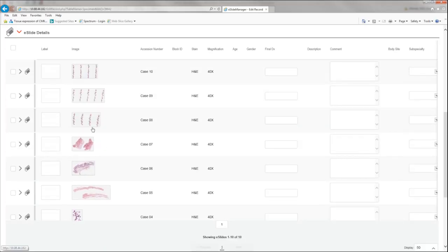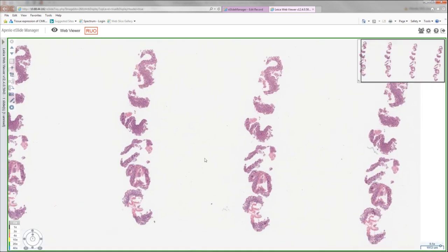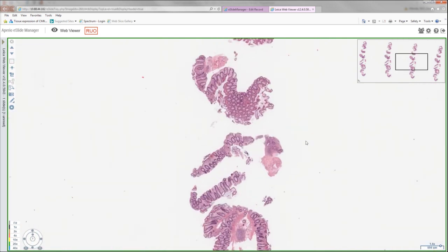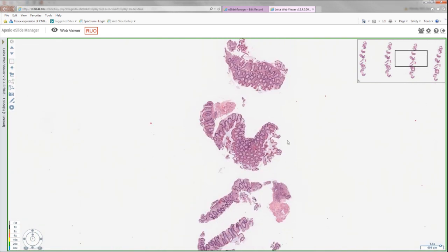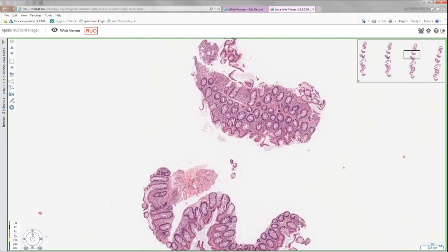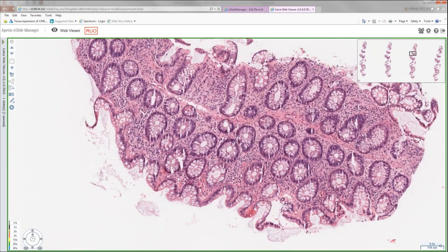So let's go here. This was a patient with a bone marrow transplant presenting with diarrhea. They didn't see much endoscopically, so they went ahead and did a random colonic biopsy. As you can see again, the architecture is fairly intact. The lamina propria is not particularly cellular in this case.